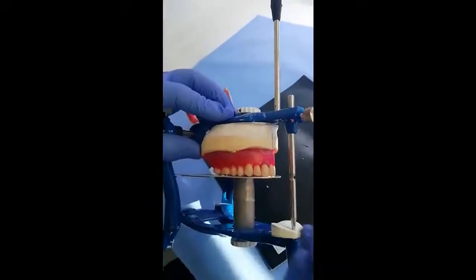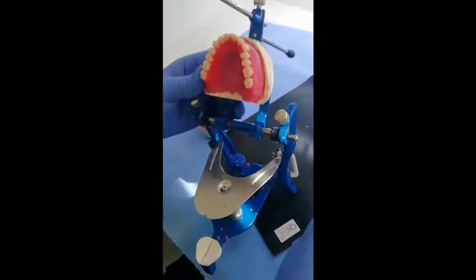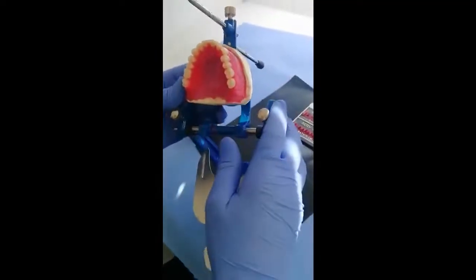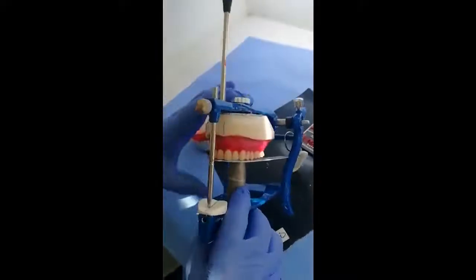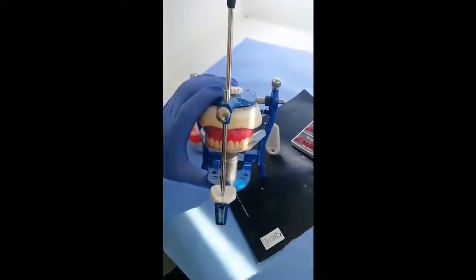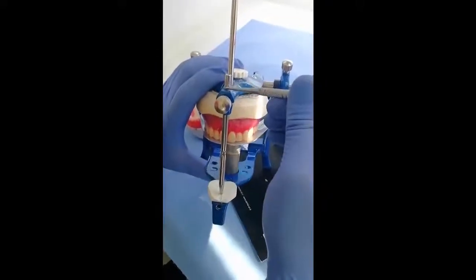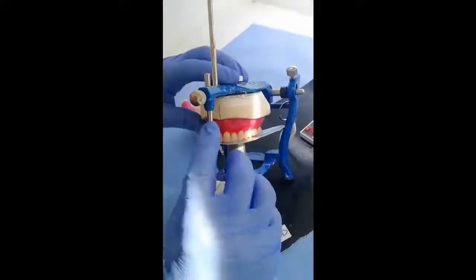as you can see here, and all the criteria of the setting of the maxillary posterior teeth must be observed and checked. And we check also the centric position. The vertical dimension is preserved by the incisal pin.